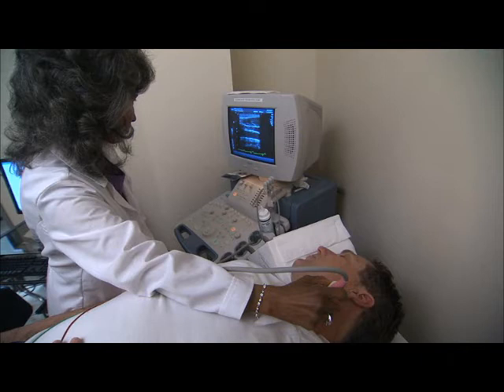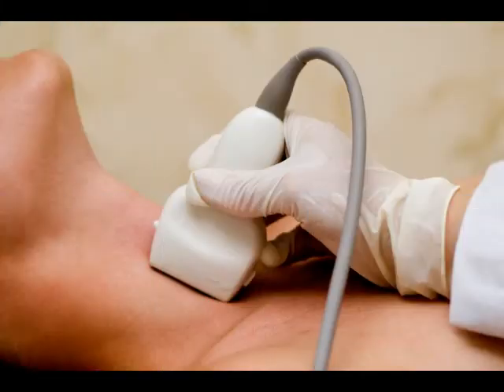Carotid ultrasound is a very common exam in our radiology department. In this video, I'm going to show you how to perform a carotid scan. Patient lie in supine position with neck overextended if possible.